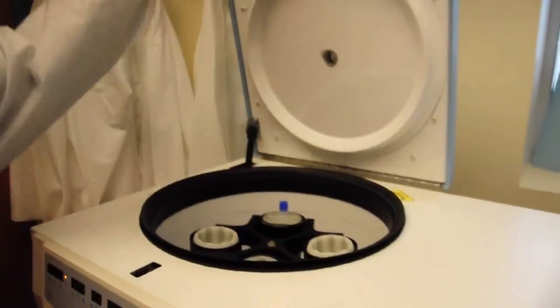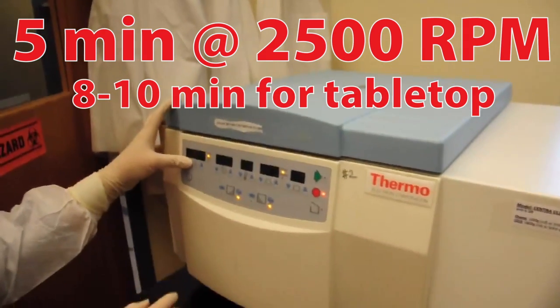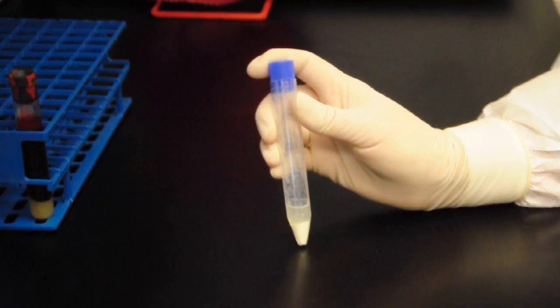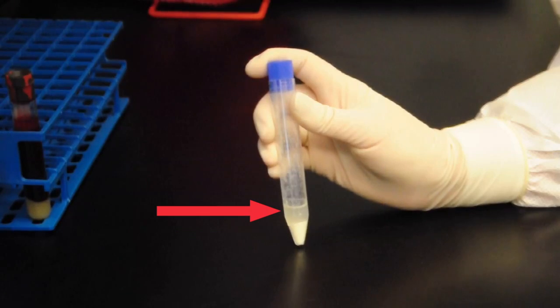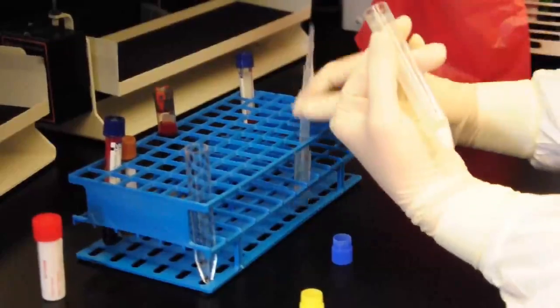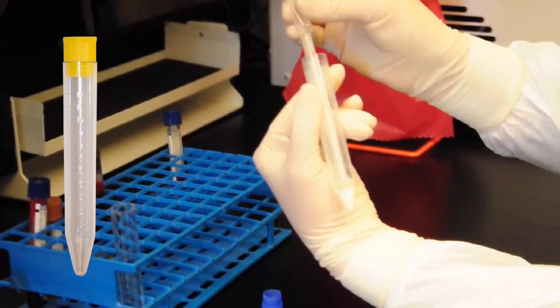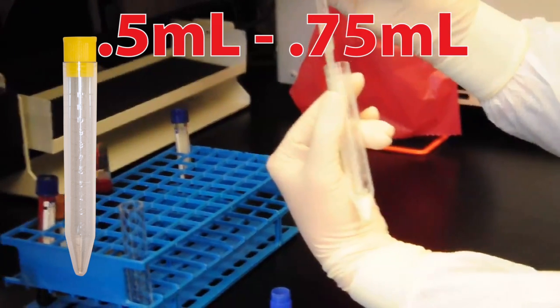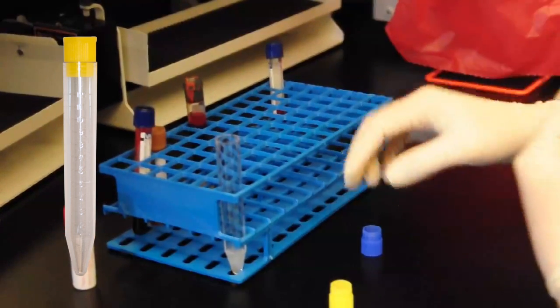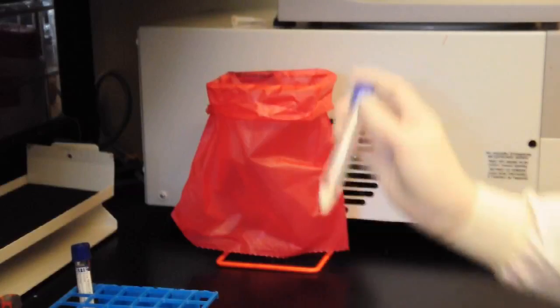Centrifuge the blue top preservative tube for 5 minutes at 2500 RPMs, or 8-10 minutes if you are using a tabletop centrifuge. The centrifuged sample should appear separated with a thin white layer and a clear supernatant. Transfer the clear supernatant from the blue top preservative tube into the yellow top tube, filling to the line shown on the tube, which is about 0.5 to 0.75 milliliter. Avoid touching or transferring the white layer or precipitate. Place the yellow top tube in the freezer and discard the blue top preservative tube.